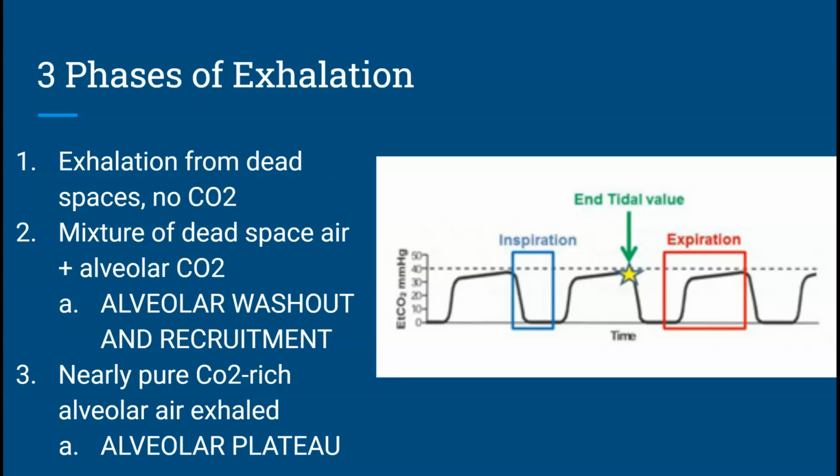So you'll see primarily oxygen here. Or it's that little pause in your breath before you exhale. Remember, as you breathe, there's a little pause for air exchange. There's nothing going in or out, and you're down here at 0 carbon dioxide.